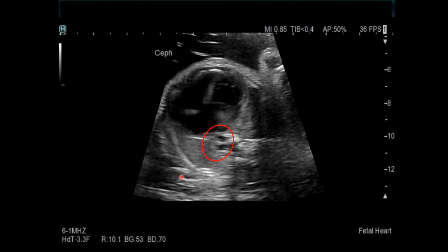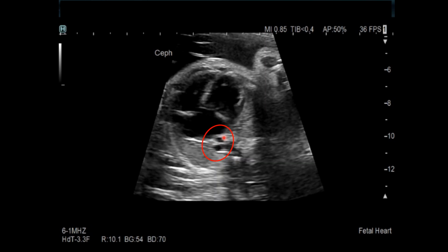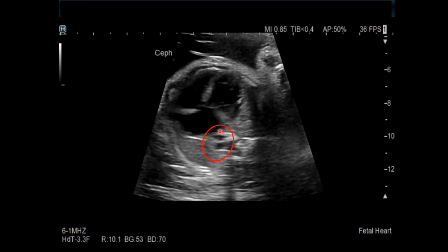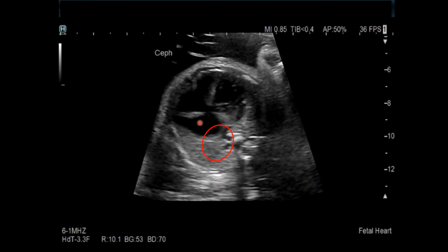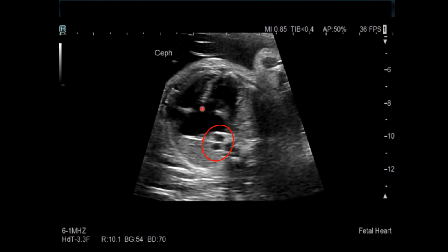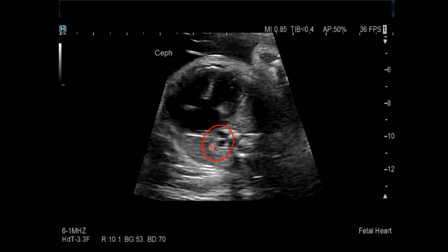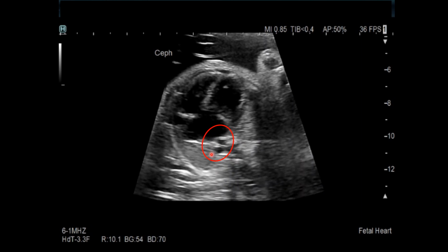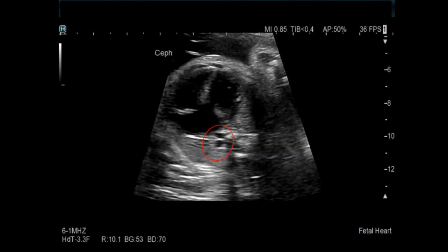Since this is left, then that is the hemiazygous vein. Here's the pulsating aorta, and that is your clue that this is left atrial isomerism with the presence of complete heart block, complete AV septal defect or AV canal defect again, and the interrupted intrahepatic portion of the IVC with hemiazygous continuation of that IVC.